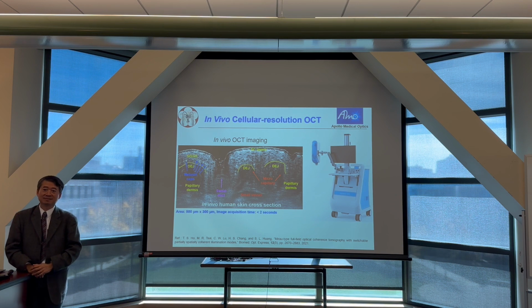So then, projecting into the future, it's possibly a general sensing technique. We go to the doctor for our annual checkup and we get an OCT scan. Is it possible that you could find these things in the images early enough that we could use it for prediction? That's our hope.